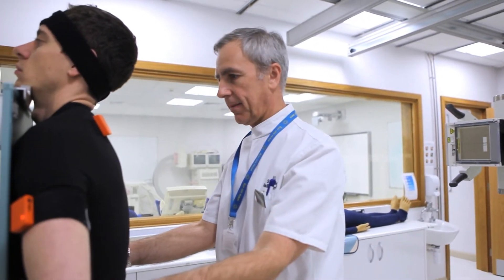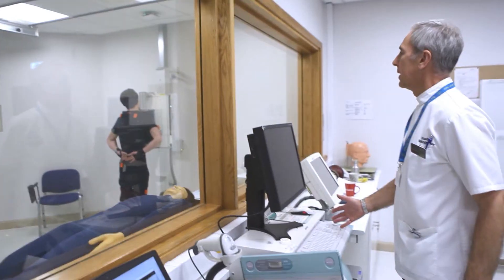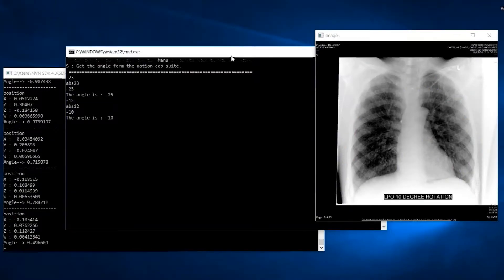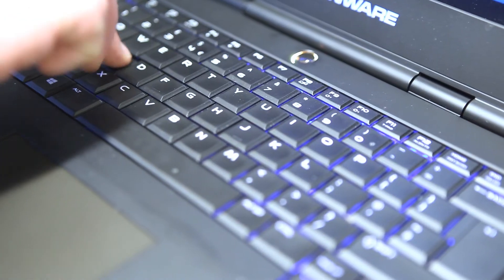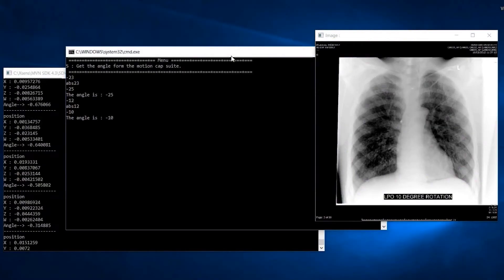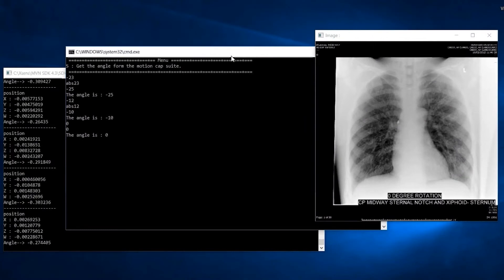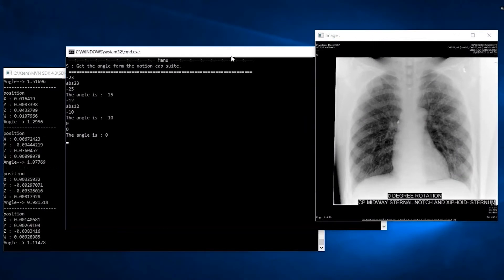That's better. And hold your breath. Lovely. So that's your final go — your third attempt. What do you think of that one? I think that's quite nice. The medial end of the clavicle seem equidistant to the spinous processes. Clavicles are clear of the lung fields.